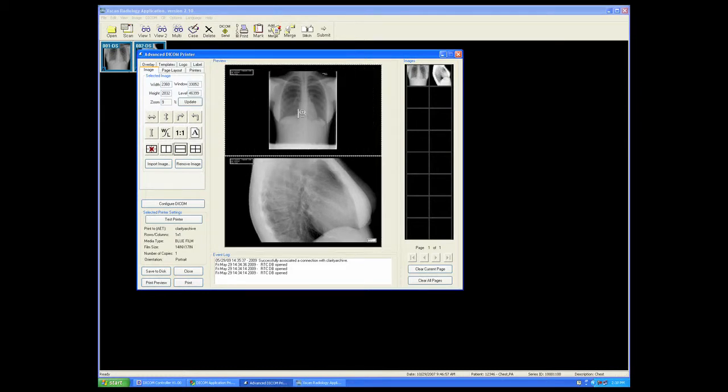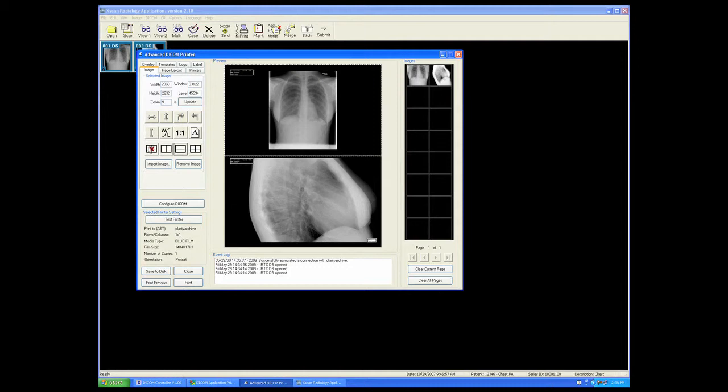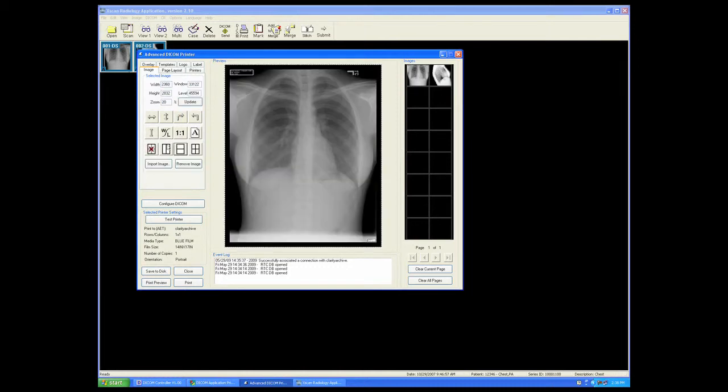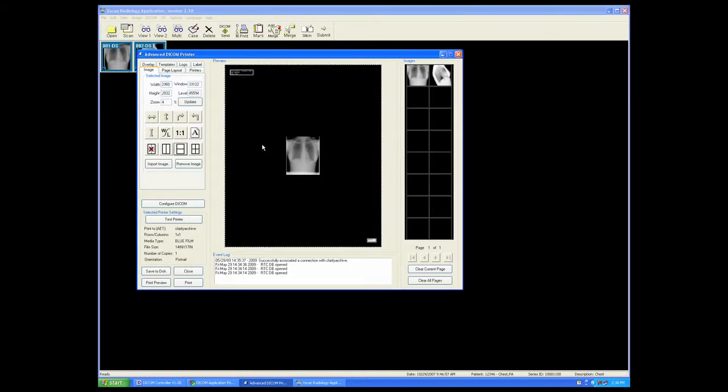Or we can force the image if zoomed to go back to full scale with the one-to-one button.